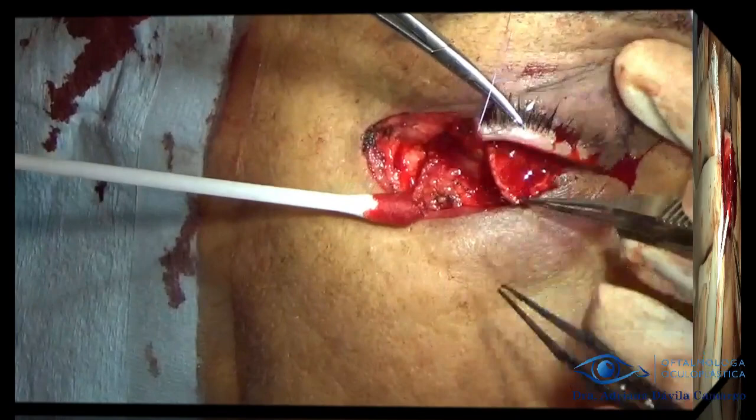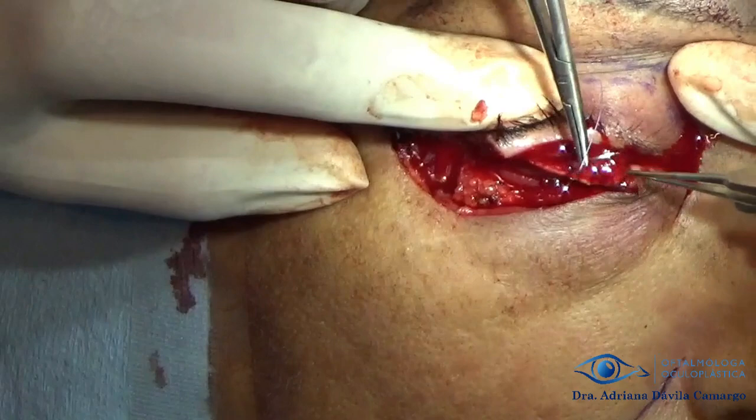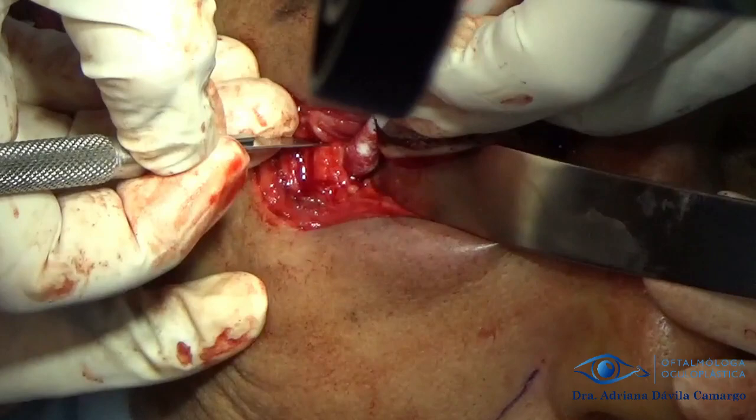We proceed to suture the flap to the medial edge of the lower eyelid defect and to the periosteum hammock. We use this periosteum hammock when we do not have tissue to anchor after resection. The orbital rim is dissected and a periosteal flap is taken, which is everted so that it can be anchored to the tarsoconjunctival flap, or Hughes flap.